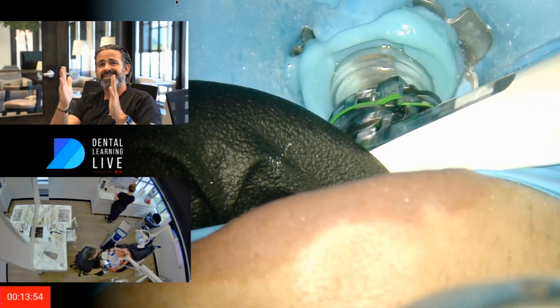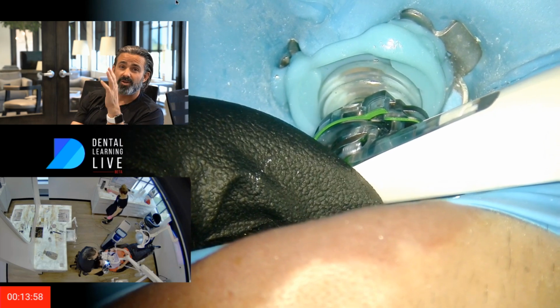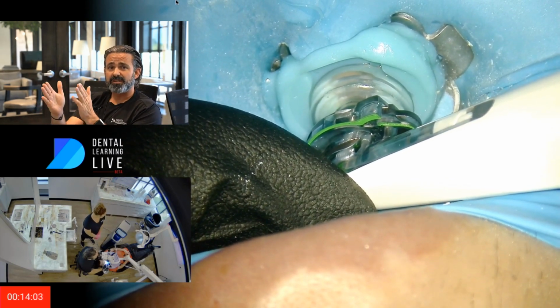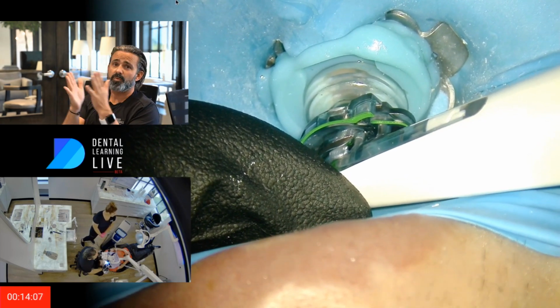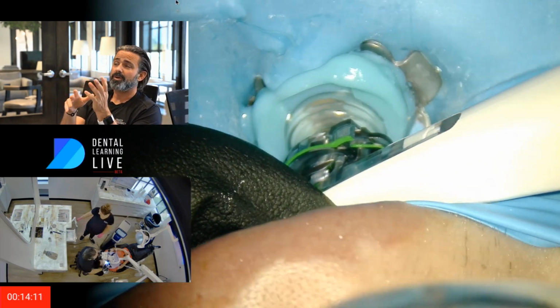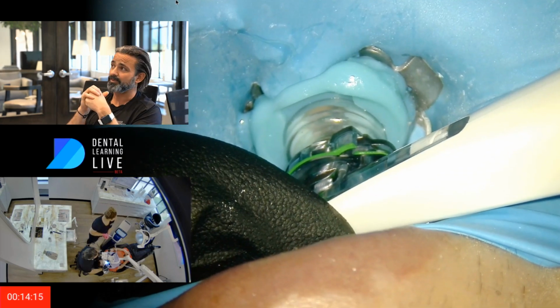That way it's maintaining the true protocol. Because this first part, the hypochlorite rinse and EDTA rinse, those are the ingredients. They're very much regimented, and they're always the same depending on what you pick. So, vital and necrotic are actually the same protocol, whereas retreatments are different in the console timetable.